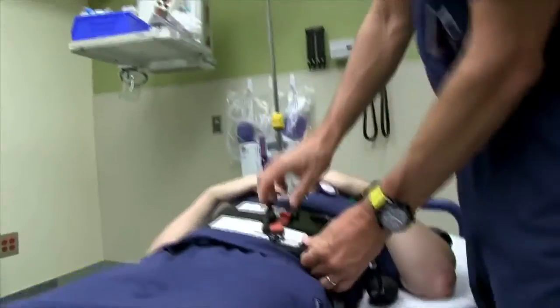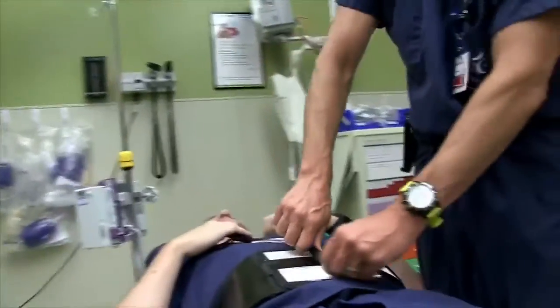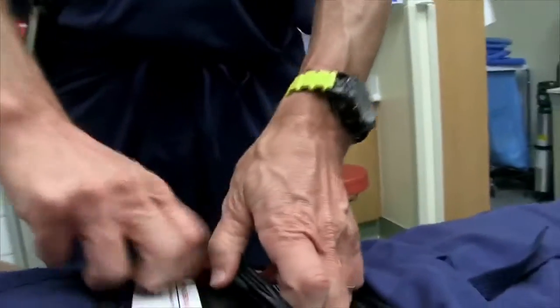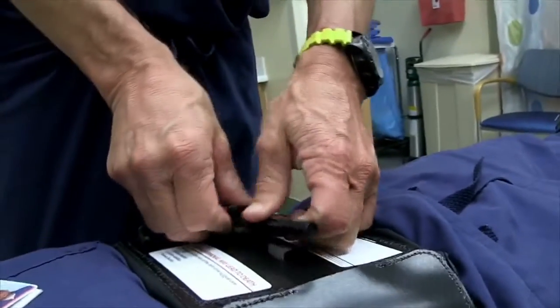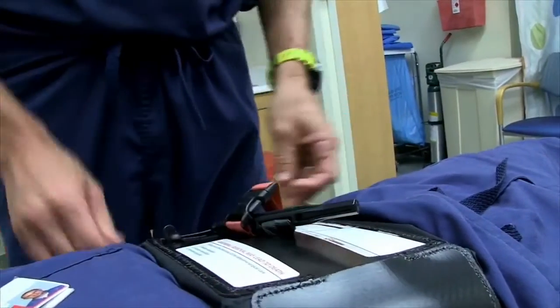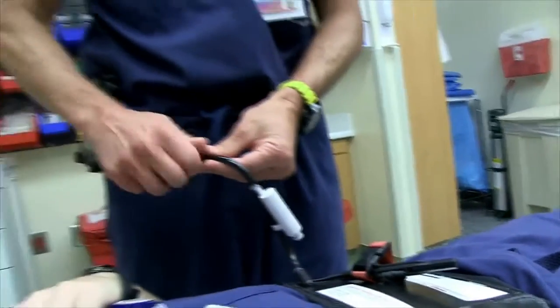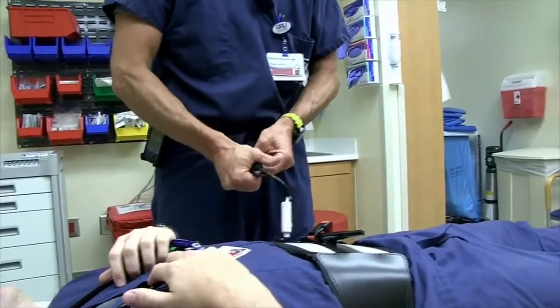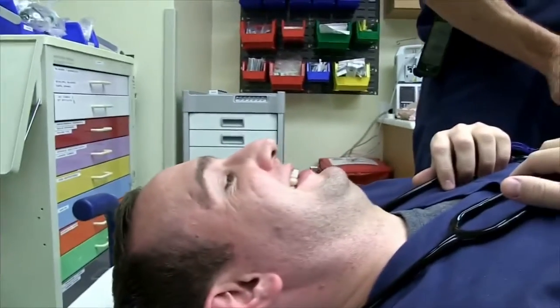We get it as tight as possible before inflation, so what we do is then tighten the windlass, which further tightens the device. Once that's tightened, then we would inflate the bulb. This is just a simple — let's watch Dr. Troncone's face here for a minute.